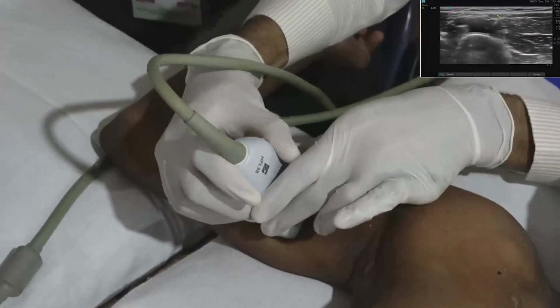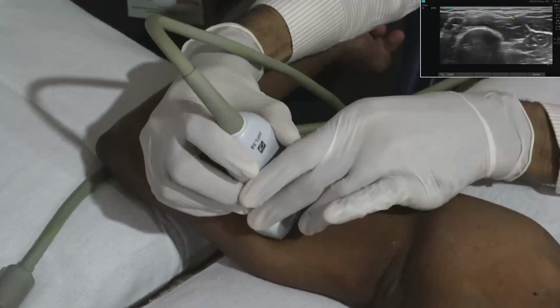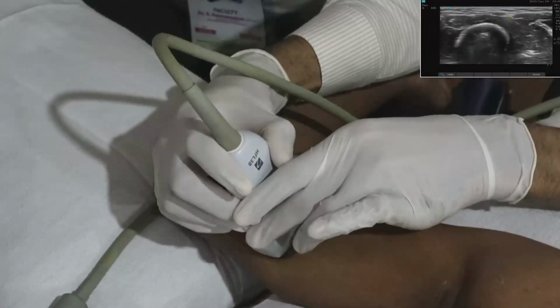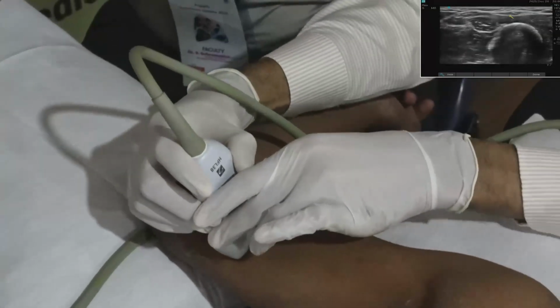If I move again distally, that nerve component is running below the brachial fascia and the subcutaneous fat. It is coming near to the medial epicondyle. So it is very easy to identify the ulnar nerve like this.